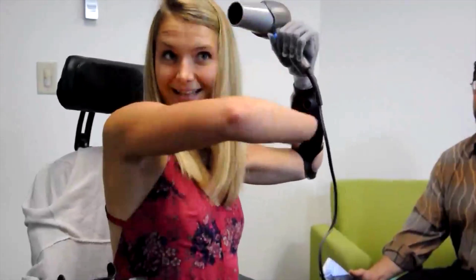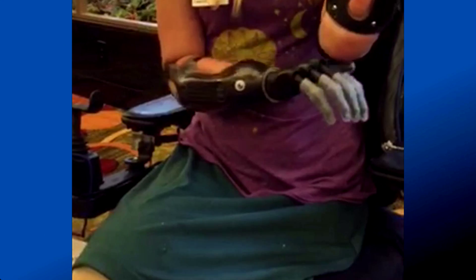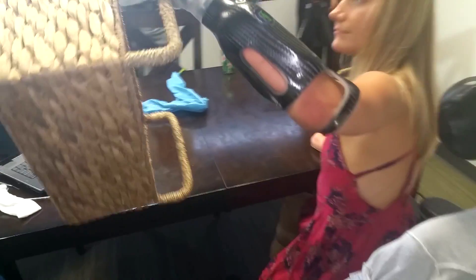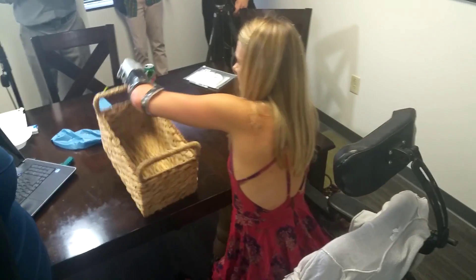Everything is going extremely well with the Hi-Fi sockets. I am extremely happy with the fit. It seems like my arms have kind of sunk into them, molded into them, so there's absolutely no pain or pressure in any areas. My elbow is completely free and clear, so I can even be holding weight and there's no pain on my condyles or anything.